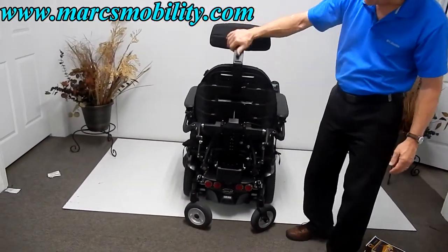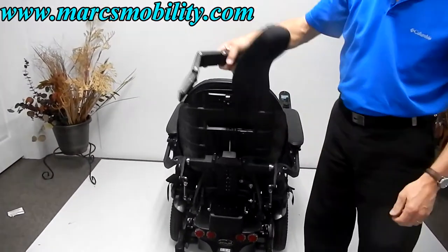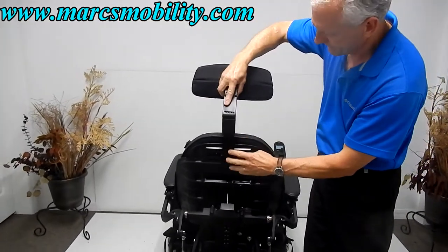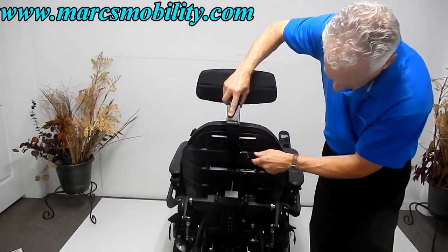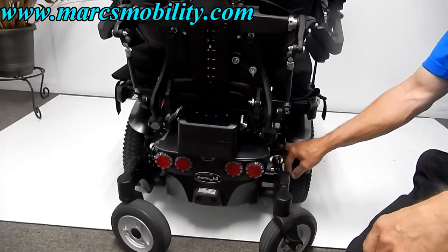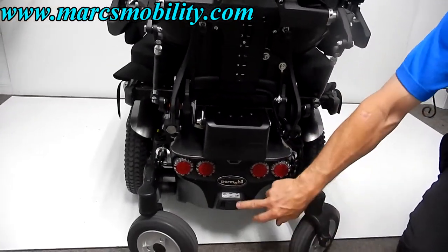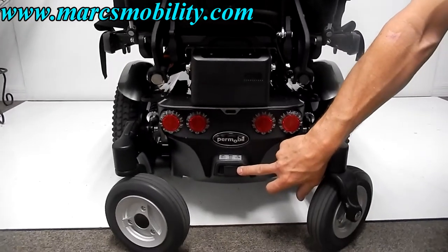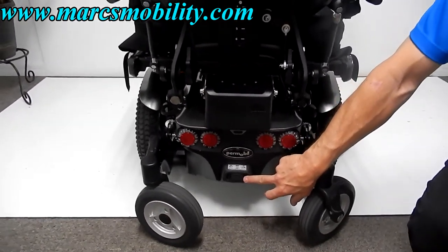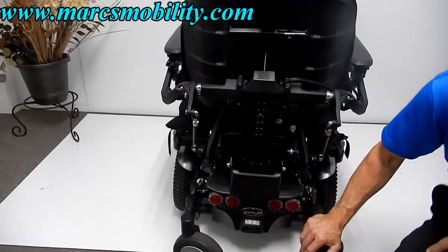At the back of the chair, you can see the headrest — it can be removed and is fully adjustable to any angle you want. Back here you also have the suspension I mentioned, reflectors, and your on/off power switch. If you're going on a long trip and want to turn the power off, you turn it off here and it cuts power to the whole chair.